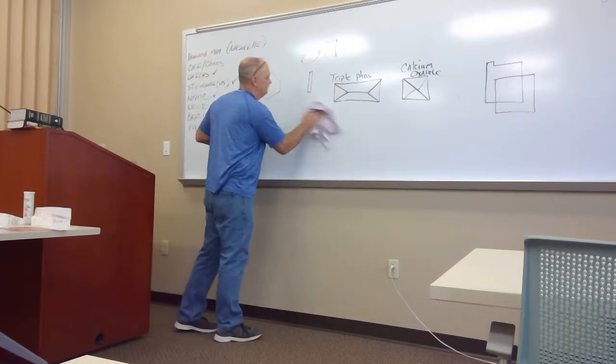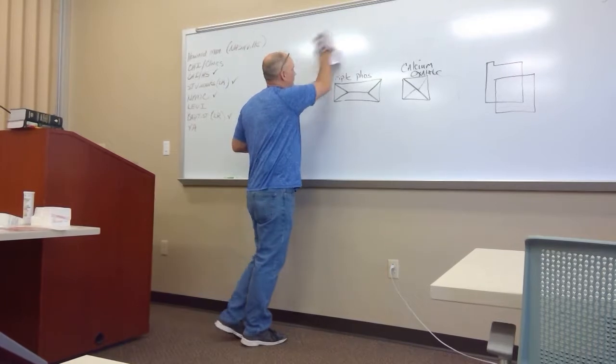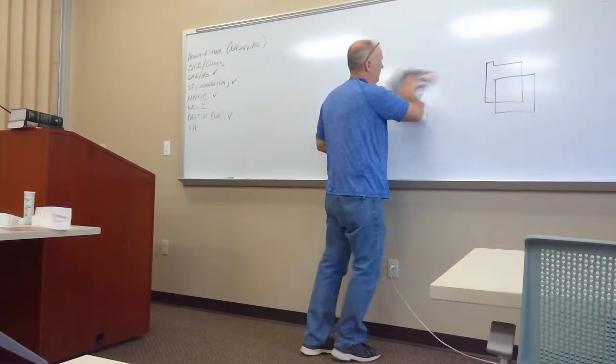All right. So ammonium biurate, what kind of urine specimen are we gonna see that in? Alkaline. A real old specimen. It's usually a contaminant of a specimen that's sat at room temperature.